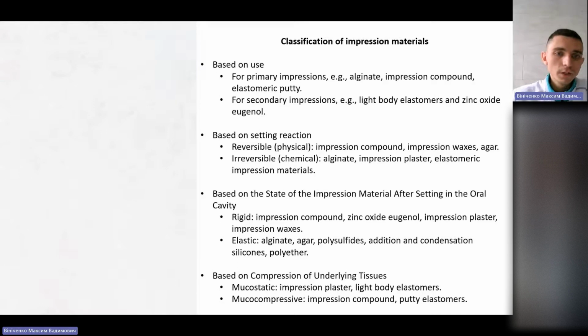Based on compression of underlying tissues, they are mucostatic: impression plaster or light body elastomers; and mucocompressive: impression compound and putty elastomers.